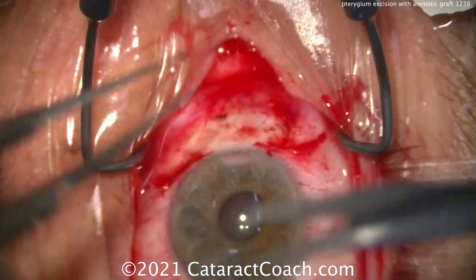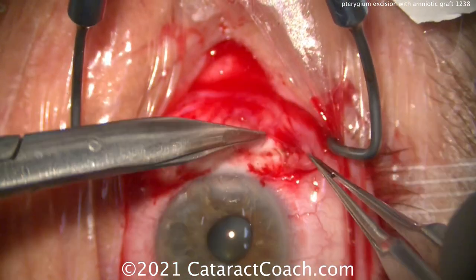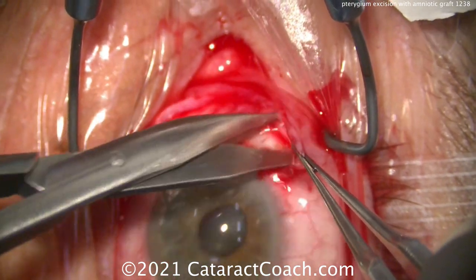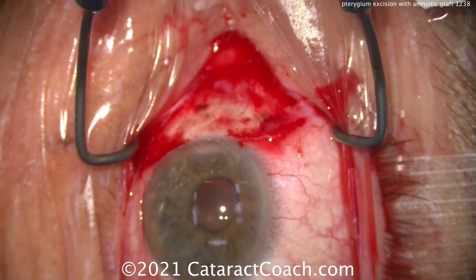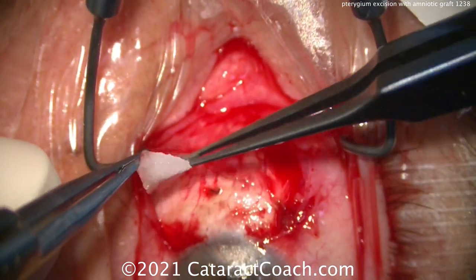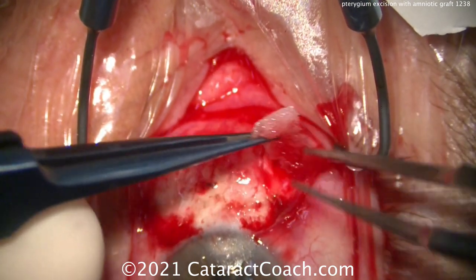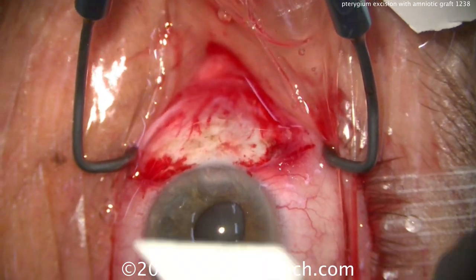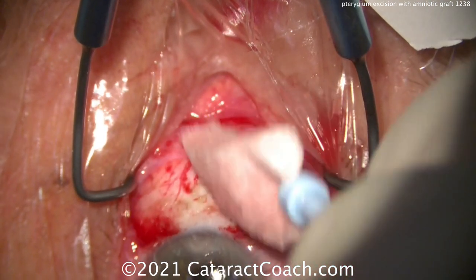Maybe a touch of cautery on that one spot. Then we'll undermine in the conjunctival fornices here, towards the fornices — we want to make our amniotic graft fit underneath the conjunctiva, so it's going to cover the sclera, but we're also going to tuck the edges of it underneath that conjunctiva. We're doing a little dissection there to create little pockets. Now before opening the graft, we're going to do a little mitomycin — not a whole lot. I don't want the mitomycin directly on the sclera — just a little bit of touching on the undersurface of the conjunctiva, and then I wash it off. Less is better. Do not cause harm — do not have a burn through the sclera. You can have a scleral melt from the mitomycin, so I don't like to apply it to the sclera, just to the conjunctival edges.